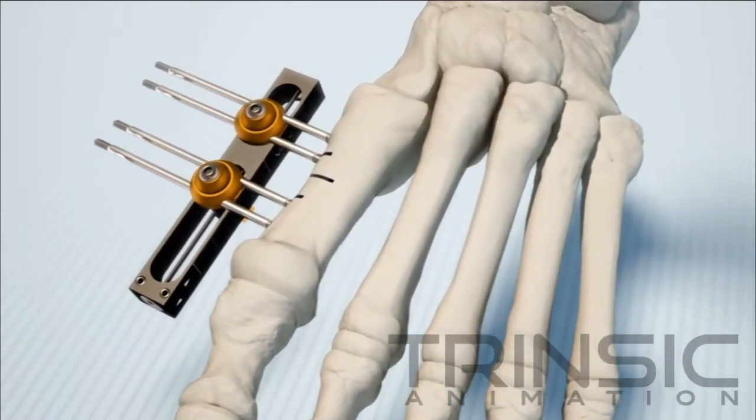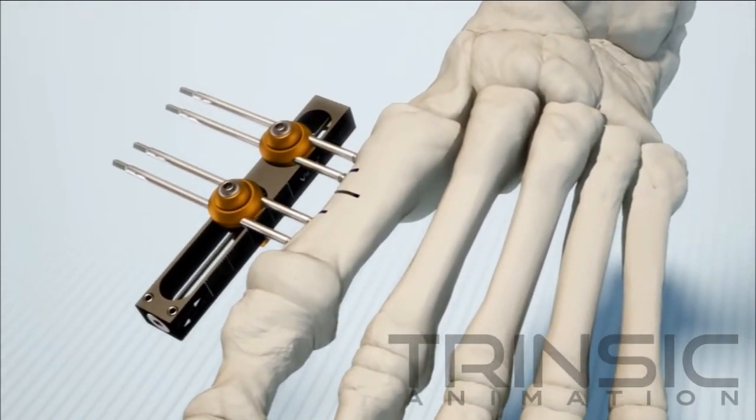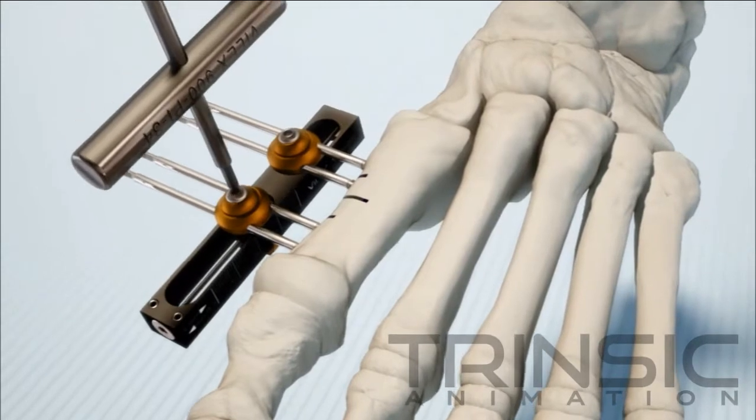Holding the foot with one hand, adjust the orientation of the rail axis so it is parallel to the direction of distraction or compression as the case may be.